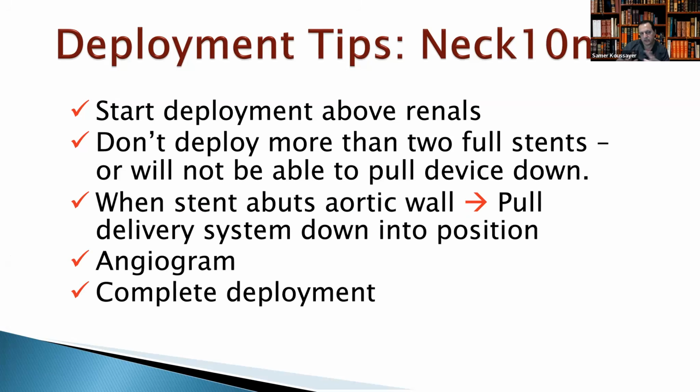So the only thing, guys, that I always tell my fellows is that when you start the EVAR, don't do an angiogram from the beginning. It doesn't help. If you do an angiogram and you put your marker and then you put your device, the marker where you marked the renal artery will be wrong, because all the devices have some angulation or aneurysms. So when you do an angiogram before you put a device or a super stiff wire, your landmark will change when you put the super stiff wire or the device, because these are stiff devices, stiff wires. So all the angulation will straighten up and all your landmarks will be wrong.